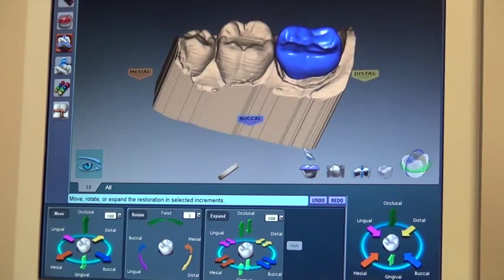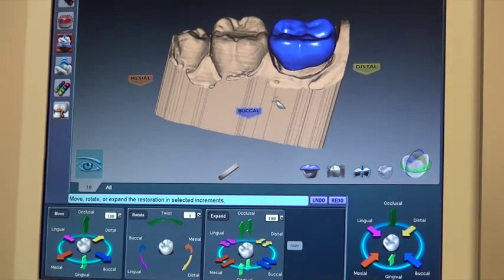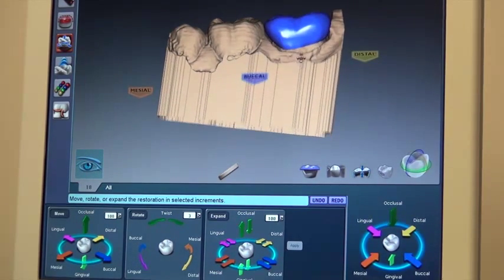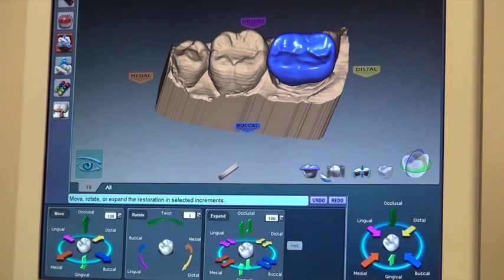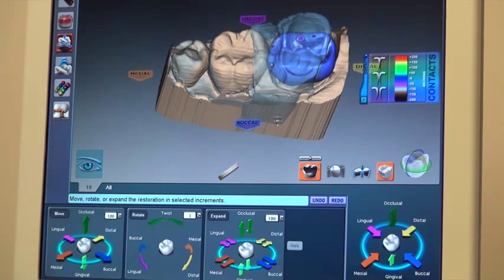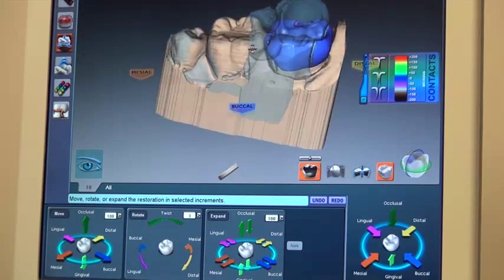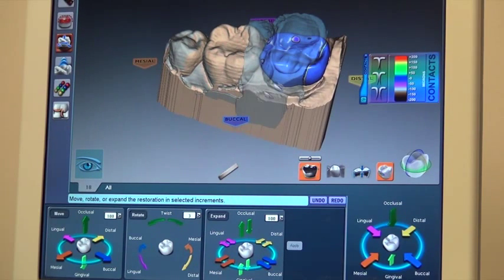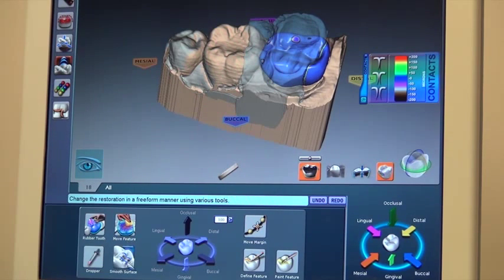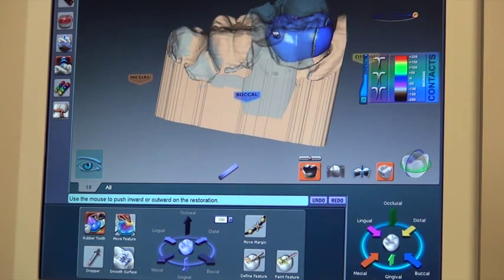Once that's done, I can look at it and there are definitely a few changes we'll need to make. I also want to check how it relates to the bite. I can highlight the bite and we can see the areas that are a little close to the biting surface of the upper teeth — we have some heavier contacts in those places. So we'll reduce those areas using a smoothing tool, bringing those contacts back ever so slightly.